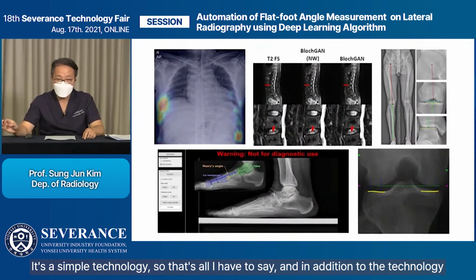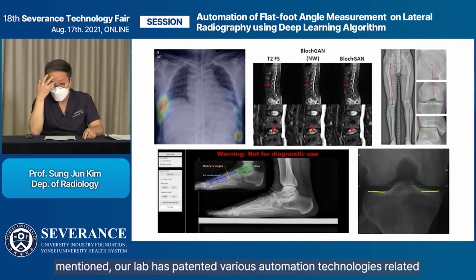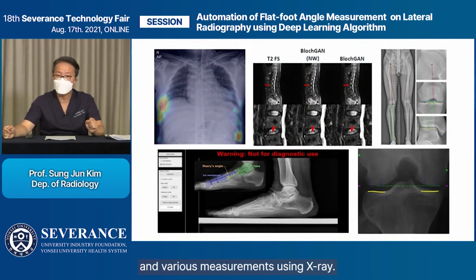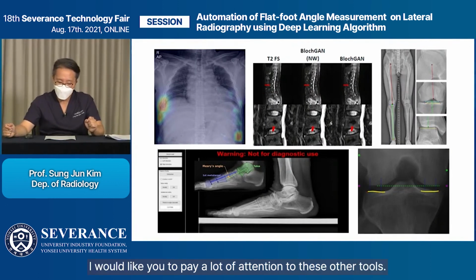In addition to the technology mentioned, our lab has patented various automation technologies related to deep learning-based fracture detection, image generation, and various measurements using X-ray. I would like you to pay a lot of attention to these other tools.